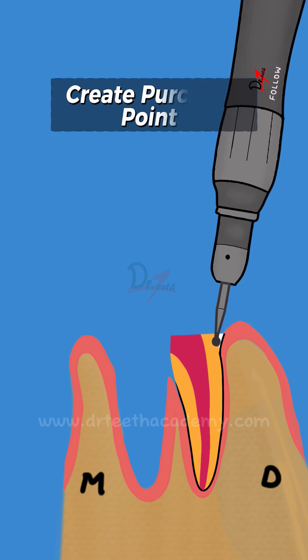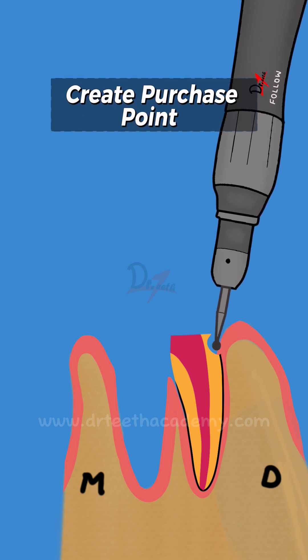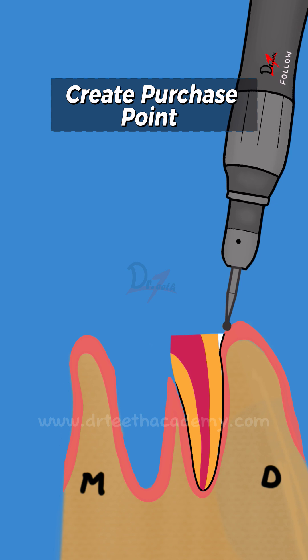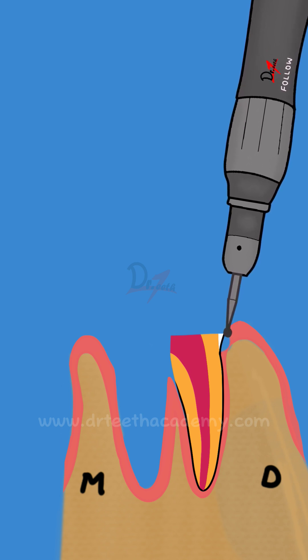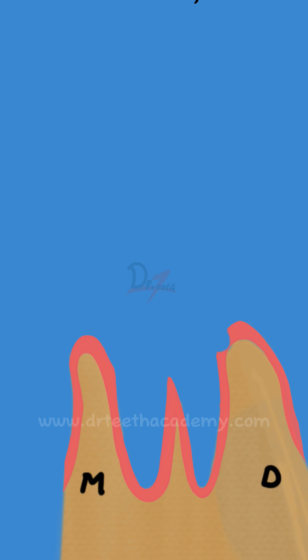Then you can create a purchase point on the root if the root is submerged just below the alveolar bone, or you can create a purchase point on the bone itself. This will help us to luxate the broken fragment.